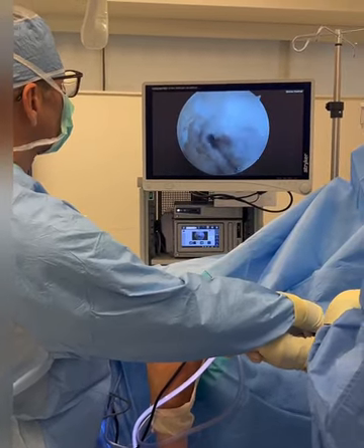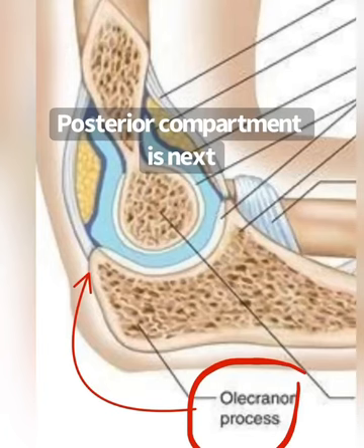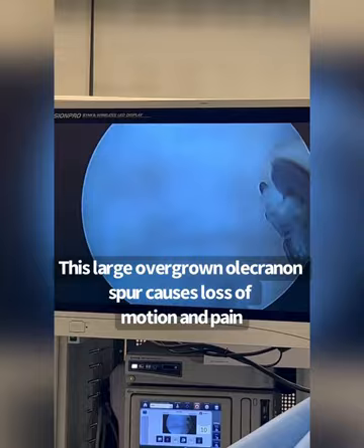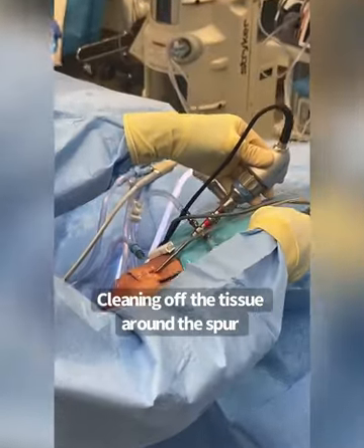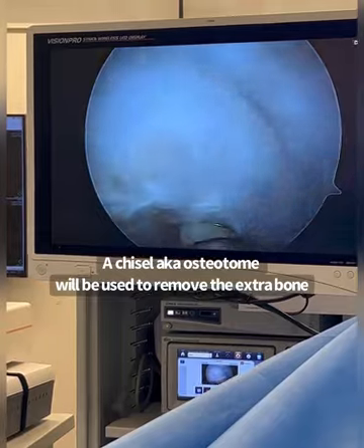Now the posterior compartment. I've put the camera in the back. This is the olecranon process — it's overgrown, it's a big spike back here, and it's also affecting this patient's extension. I'm just clearing the little area where I'll place the chisel-like instrument and removing this little spur right over here.